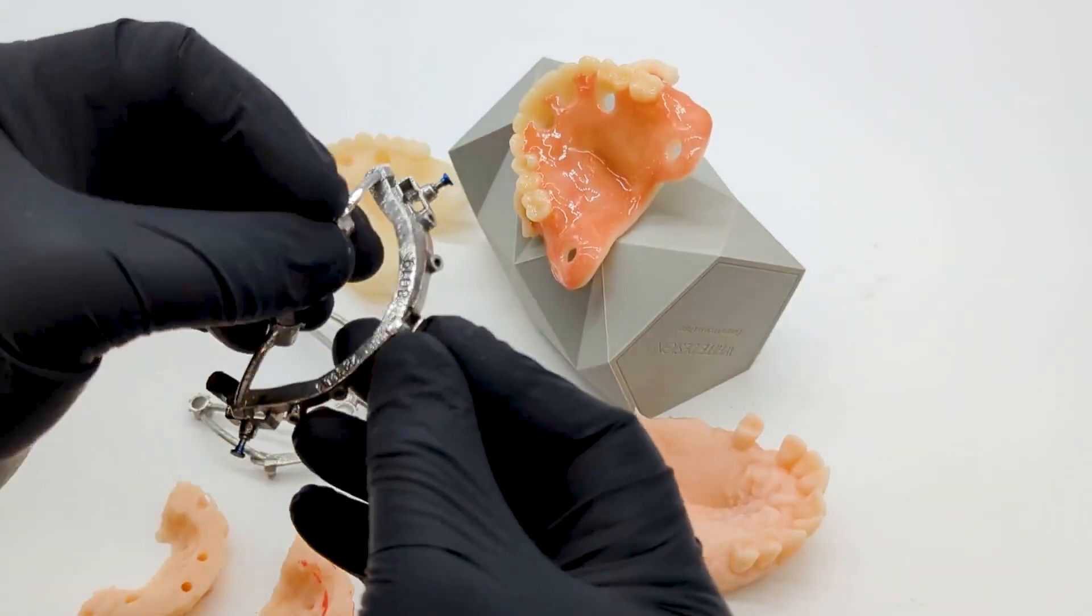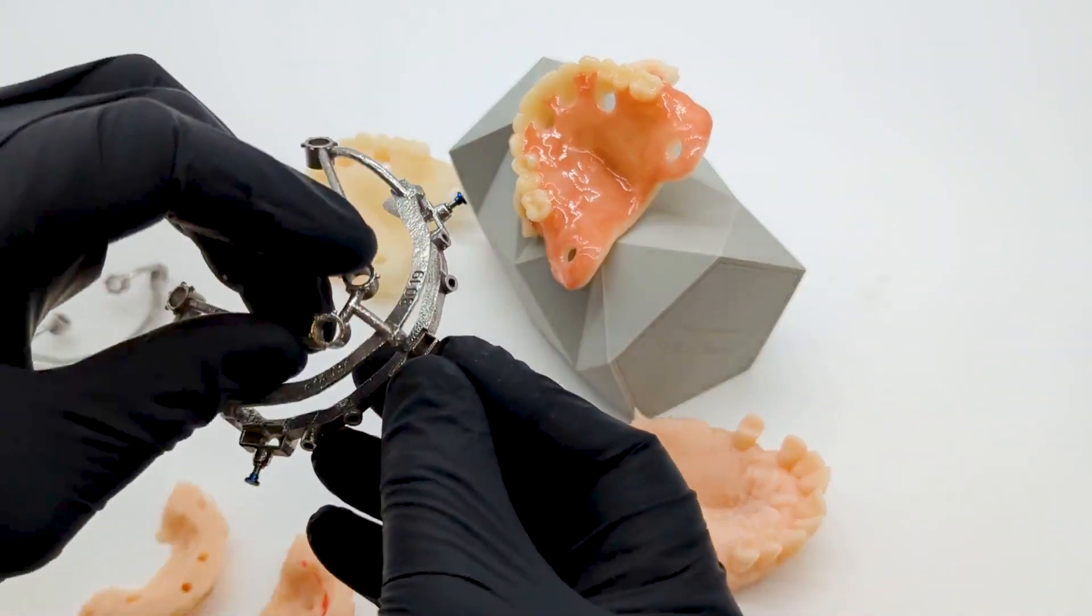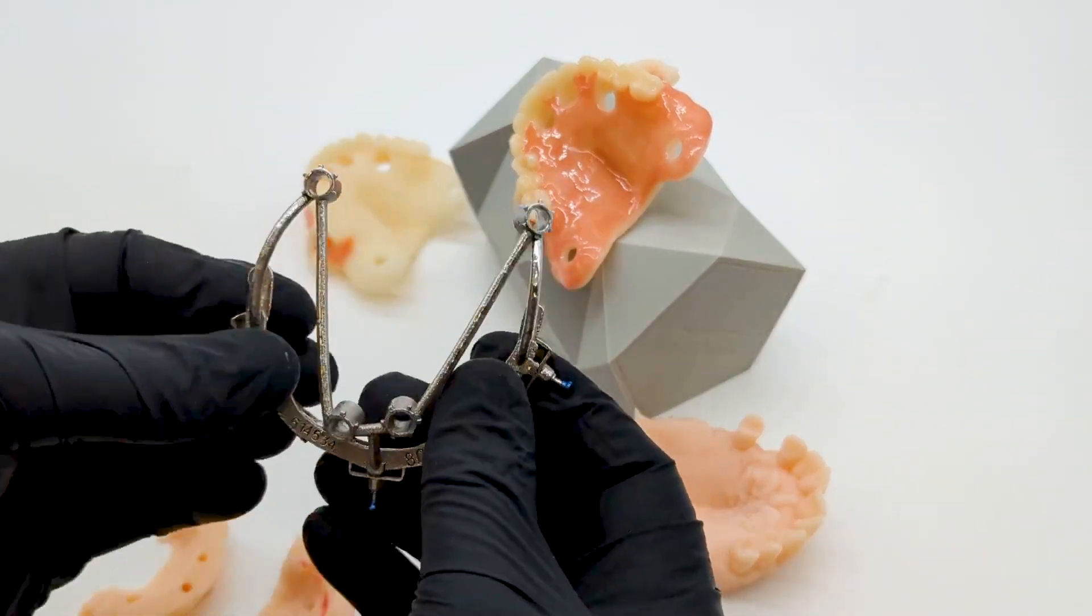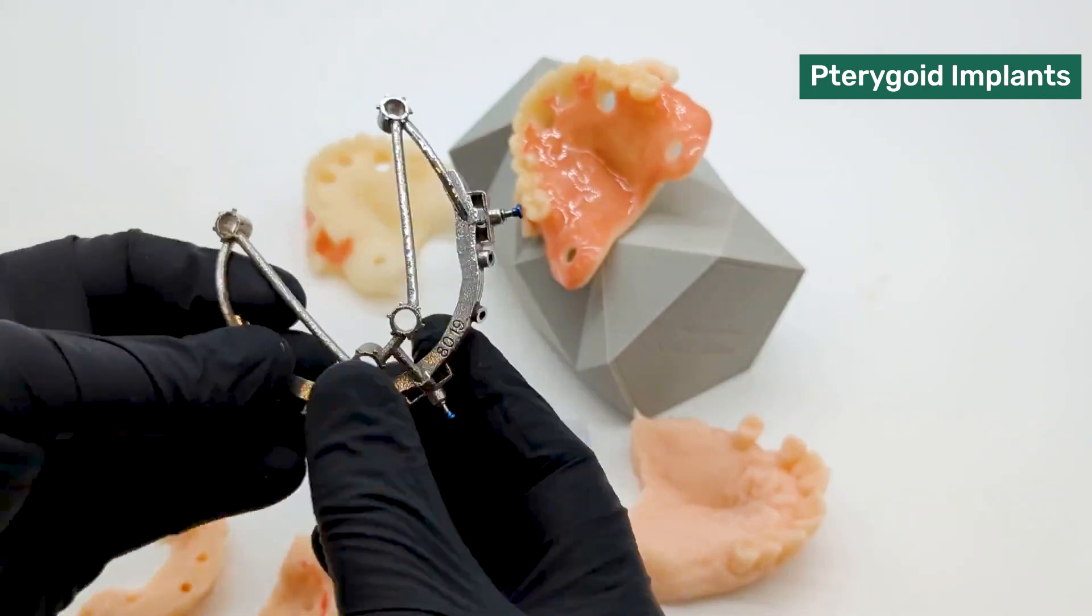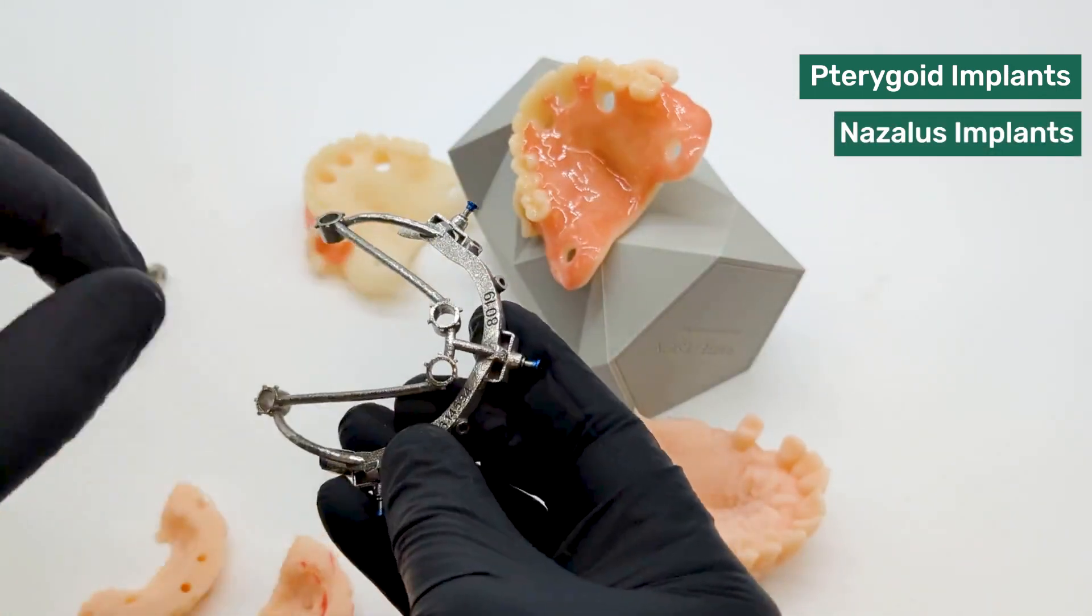Once those implants are in, then we're going to guide a couple of pterygoids. So those are also angled. You can see the nubs here, and then two implants in the anterior.